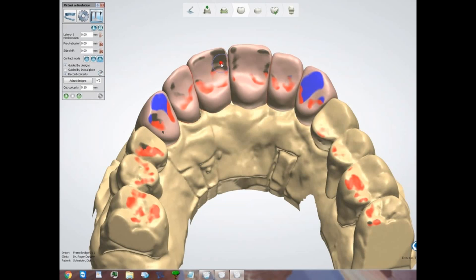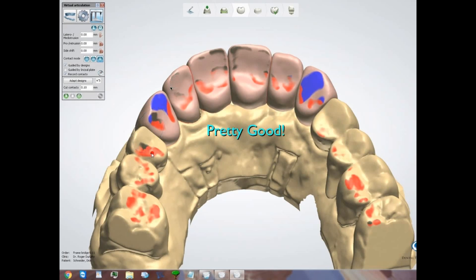Notice what happened: I got a little protrusive on my lateral — and that right there is the kiss of death. Some protrusive here and here on the centrals is okay, as long as it's in harmony. But protrusive on the lateral is the culprit responsible for a lot of those disto-incisal failures on laterals — those are working movements. We definitely want that not to be there, so make sure we get rid of those. Anything coming from the fossa up to the meso-incisal in harmony with the centrals is pretty much okay.